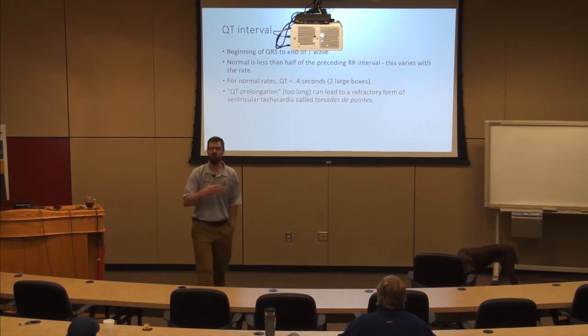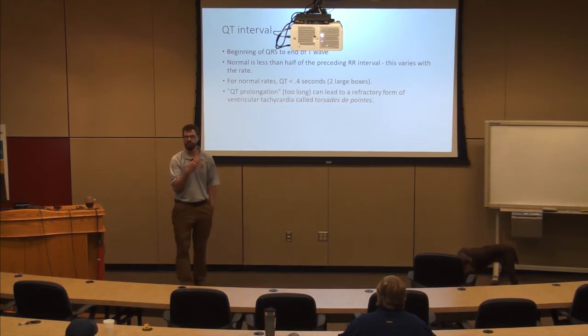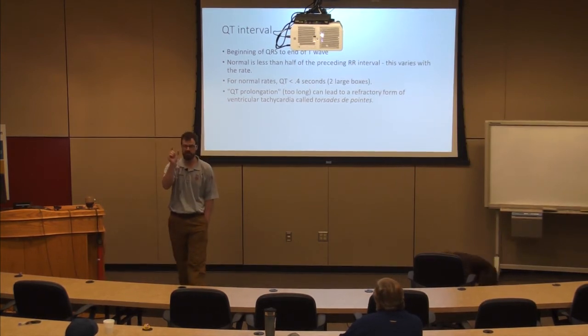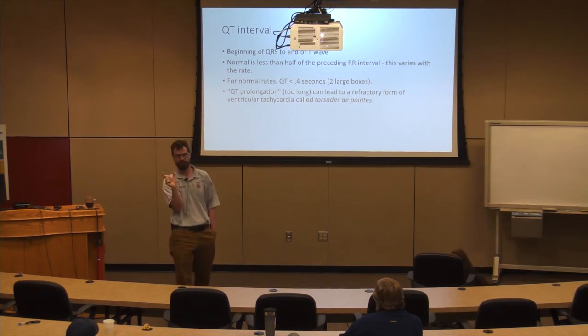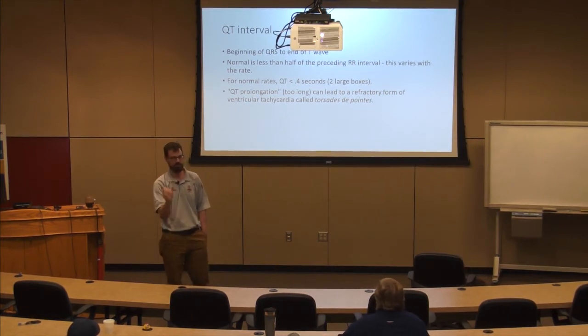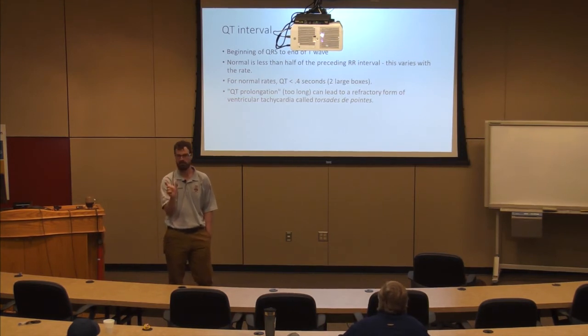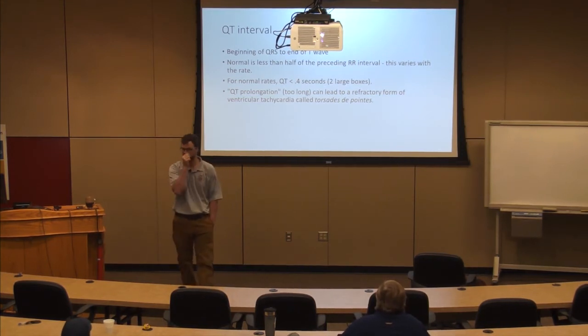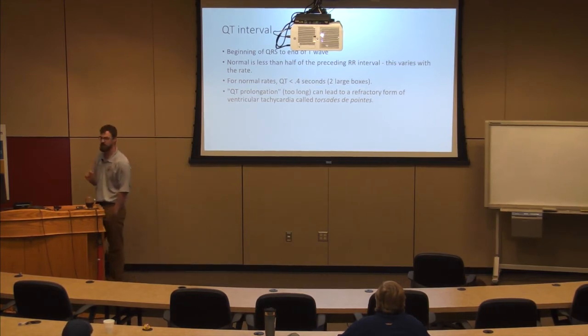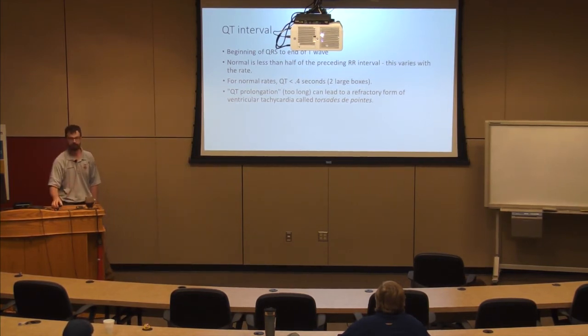So there's not a lot that I can do to treat QT prolongation. But I can say in the back of my mind, this person has a high risk of torsades, particularly when that QT interval gets over 500, okay? That's why I just keep the number 500 milliseconds in my mind. So if I have a QT interval that's wide over 500, I'm anticipating torsades, right?